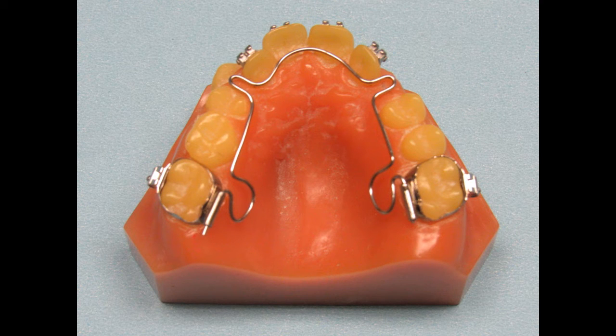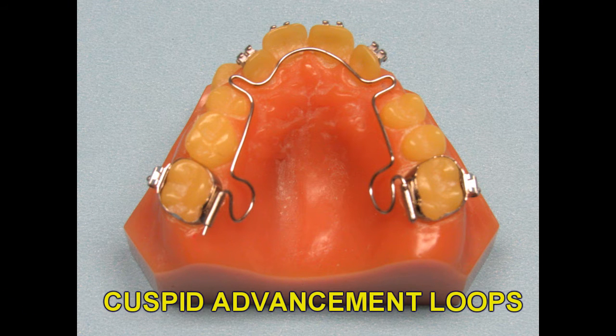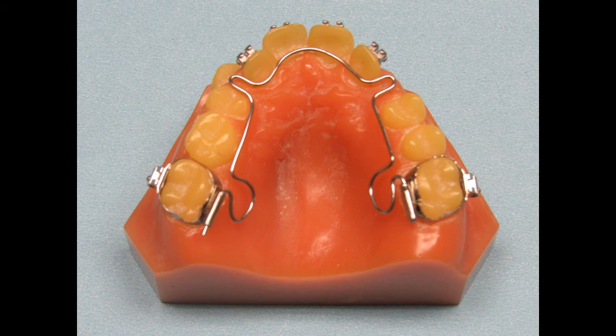In cases where the cuspids are blocked out, we can add adjustment loops in this area. The loops allow you to gain additional space in the cuspid area where you need it in order to create room for the cuspids to erupt properly. You will need to request these loops if you would like us to include them in the appliance.